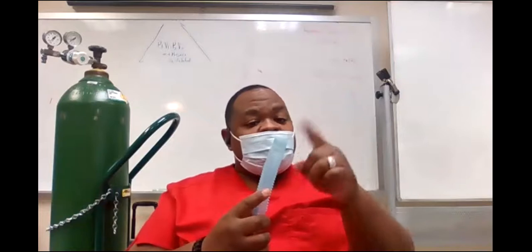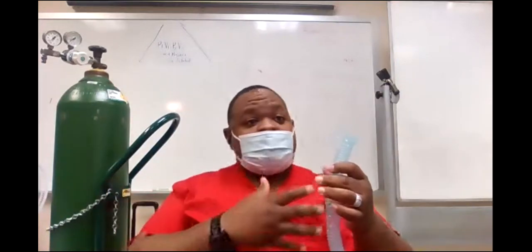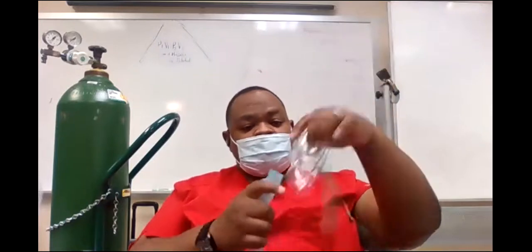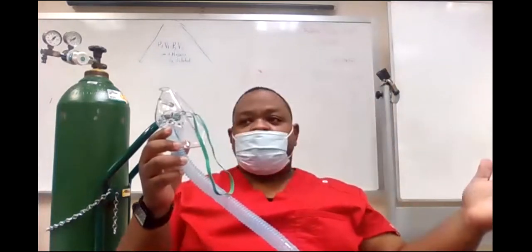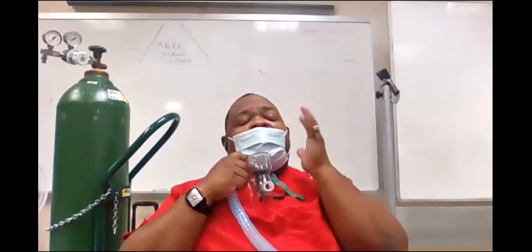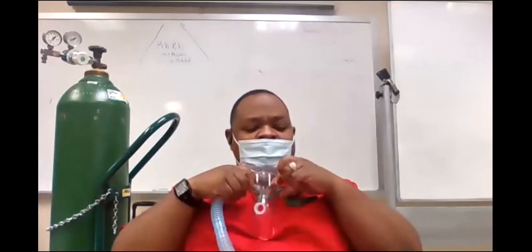Now, whatever I put right here is what it's called. This is aerosol. Say aerosol. Face mask. Say face mask. So if I put this on here, this system is called a what? Thank you. If this is called a face tent, this is a face tent for people who have burns. If your face has been burned, they had a bad house fire and they're in the ICU and they're burned, you don't want to put this on their face. You don't put a mask on, right? This is a face tent.